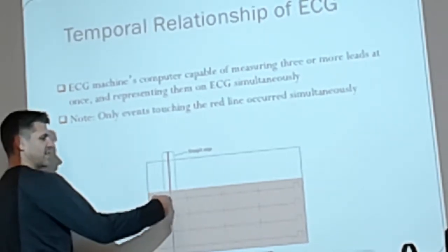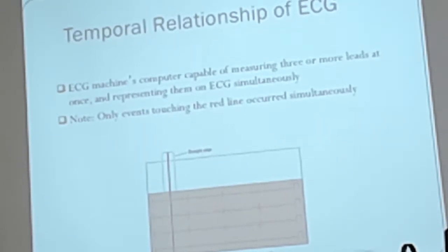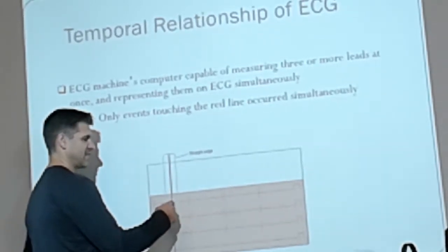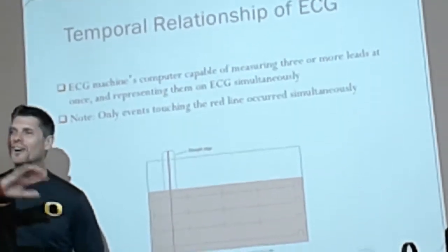If there's a P wave here in lead one, on this red line, and a QRS complex here on the red line in lead two, what does that mean? Different views. I realize I'm asking a trick question. It's an impossibility. Unless there's something wrong with your heart. Unless it started from the AV. Whatever happens right here has to happen right here as well. Unless you have another living organism that is jumping on top of life. But we'll start with what I said last week, which is we're assuming that everyone's normal first.